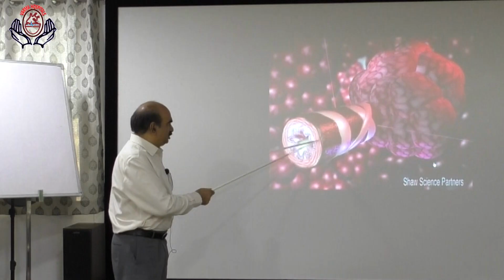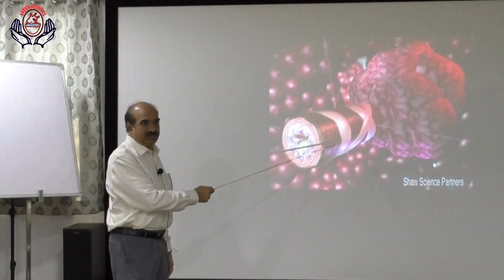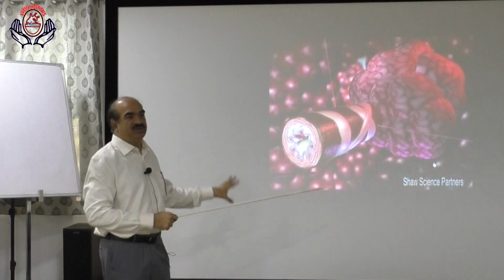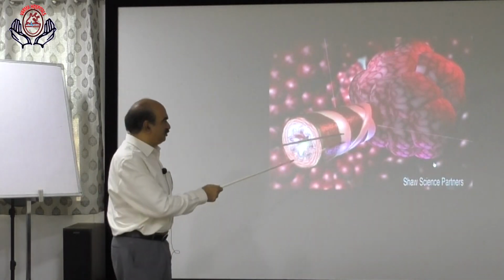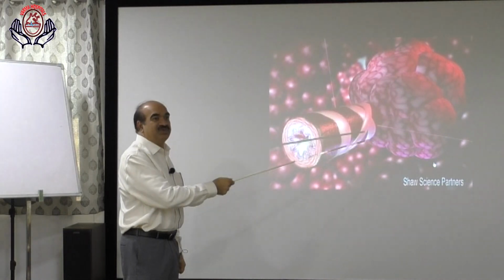So if you find ventilation failure, if there is high CO2, we should start with BiPAP in NIV. If you observe ventilation failure, or combined ventilation and oxygenation failure, we should start with BiPAP.